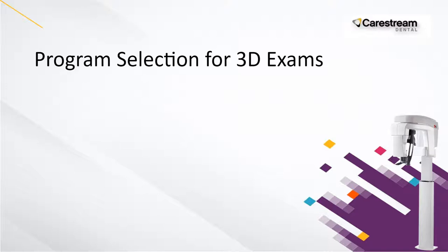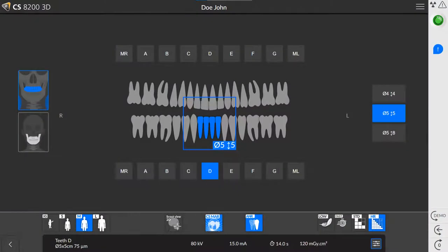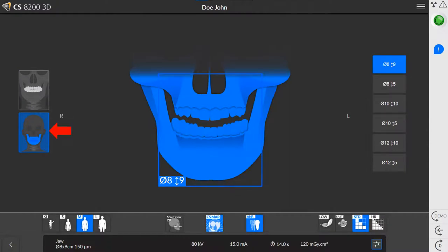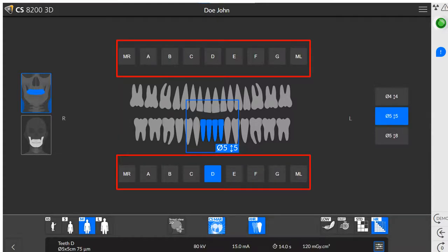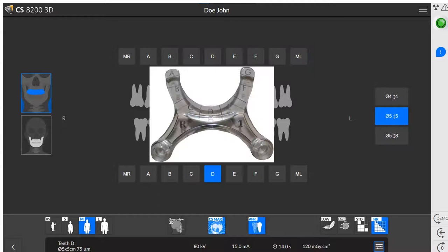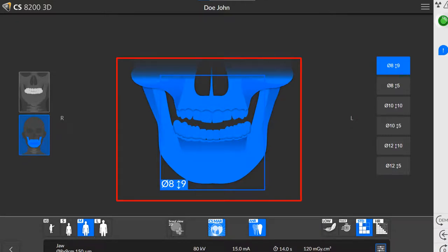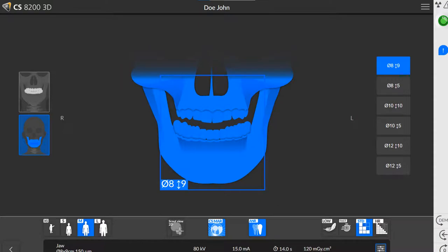For program selection for 3D exams, you can choose between two programs: focus exam, also known as a teeth exam, and jaw exams. Click teeth exam and click the area you would like to examine. Click on a letter to select an area of interest. The letters on the main interface correspond with the letters on bite block 1. Click JAW exam and choose the area you would like to examine. The following JAW 3D program types are included: upper arch, lower arch, and full JAW exam.